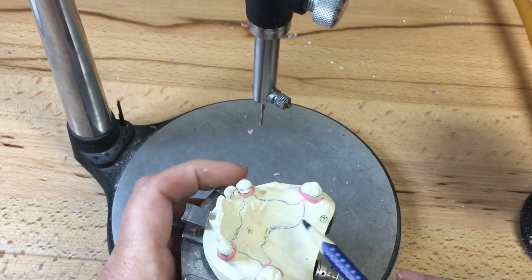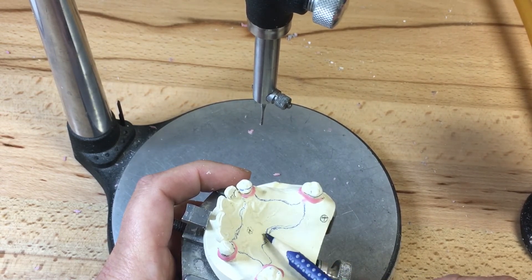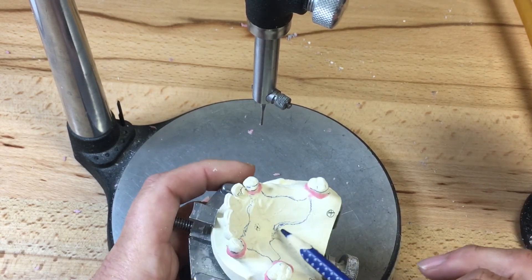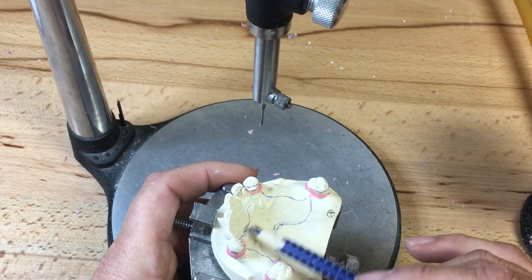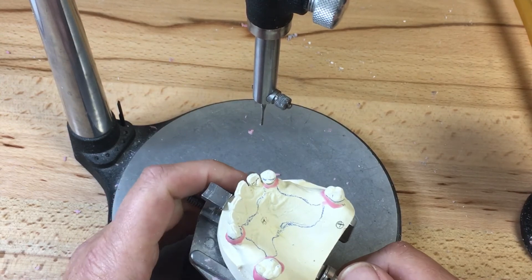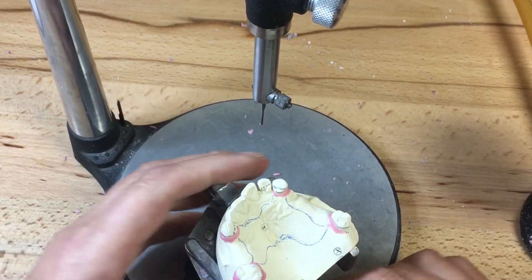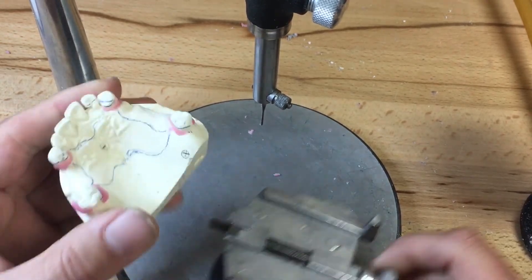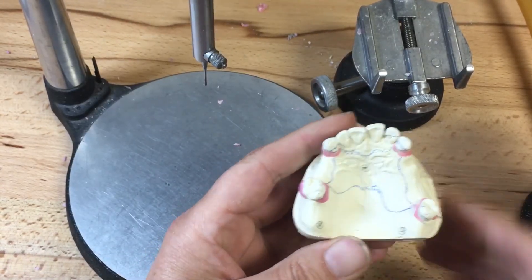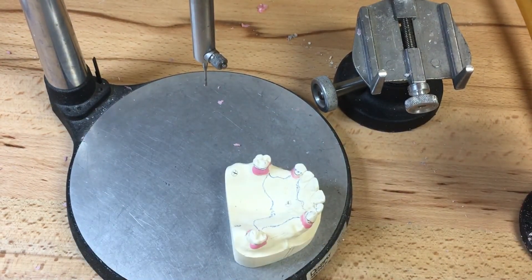Here we have our major connector — not quite symmetrical yet; I'm going to move this up a little bit. The more anterior line is more symmetrical. This stops us from making a straight posterior palatal bead line going from the midpoint straight to the guide plane in a straight line, making a Dorito-chip type of major connector. We need to have some symmetry and curvature — no straight lines.